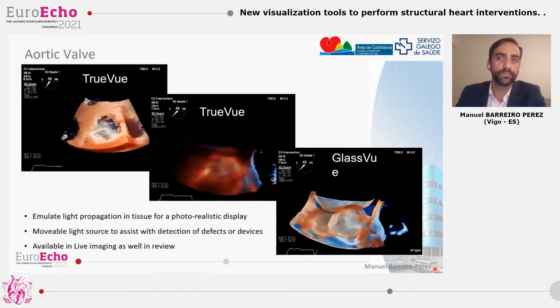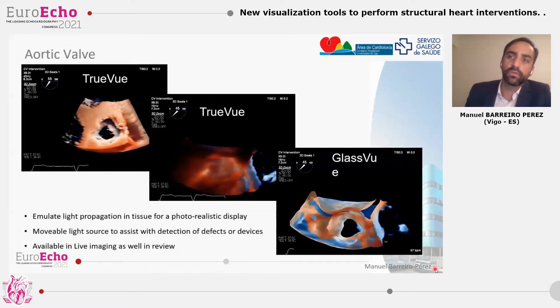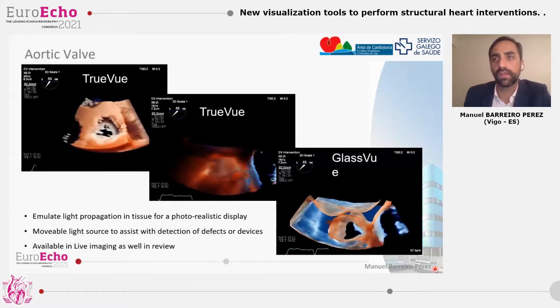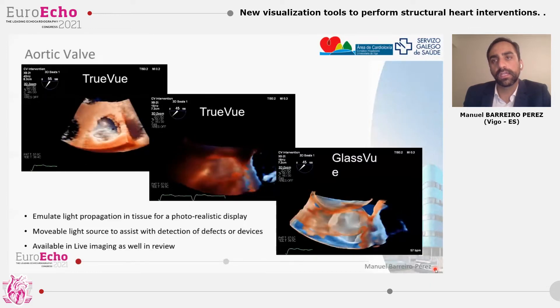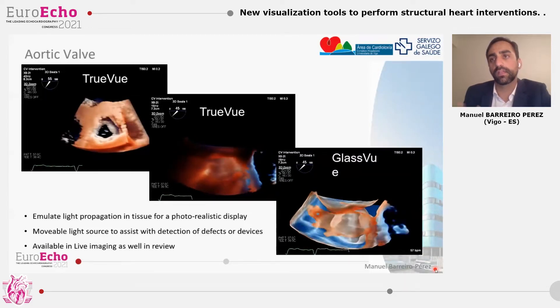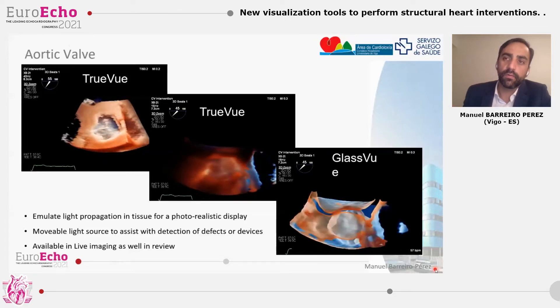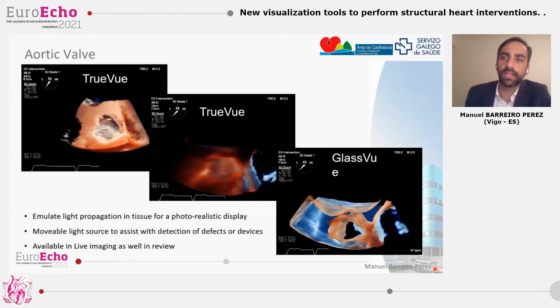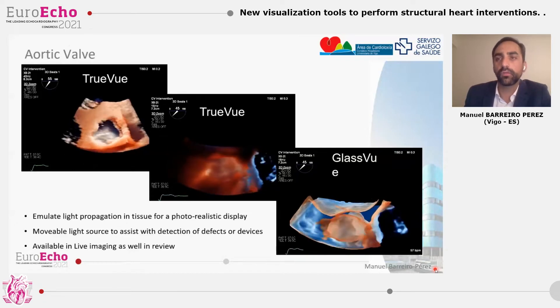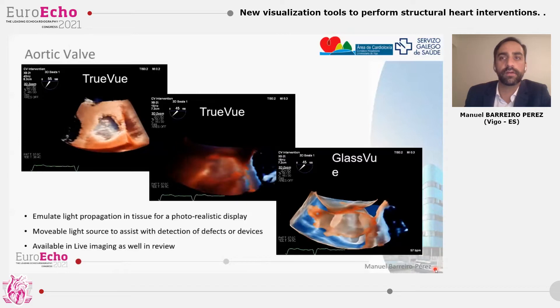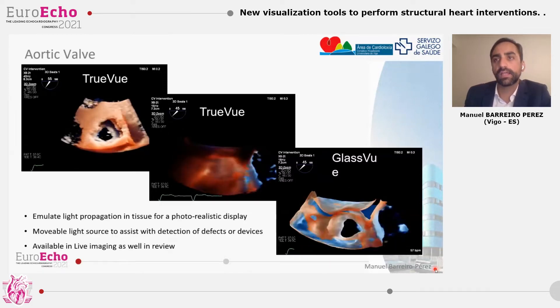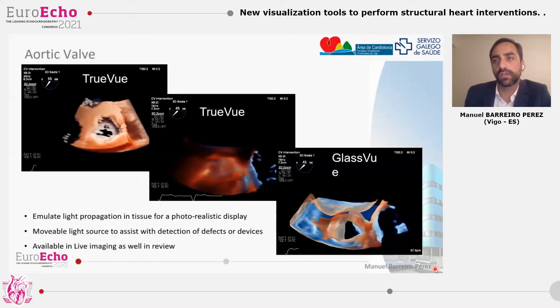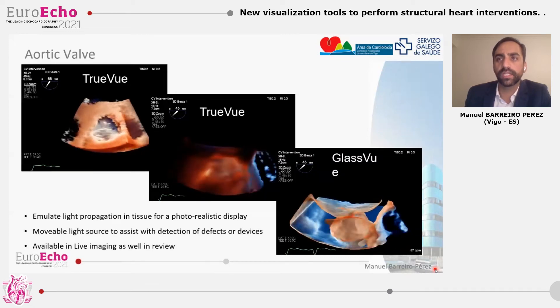Attending to the first point, I'd like to talk about these two 3D photorealistic renderings: the true view and the glass view. Both of them have a closer representation of the anatomy to the anatomical pieces, but more interestingly, they have the ability to move the spotlight in any position of the 3D volume to improve and enhance the 3D perception for the reader. It's also possible to place the light behind the tissue and study any structure with transillumination capabilities.